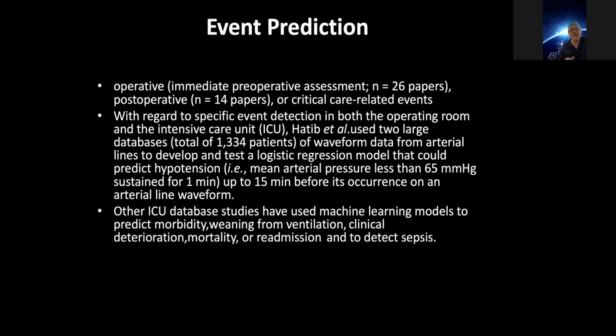It's very difficult for us to predict, for example, hypotension. Right? I mean, I obviously measure the blood pressure on a regular basis in the operating room, but to predict when the hypotension actually occurs, when mean arterial pressure is less than a certain level, is very difficult for me, because I look at one value, well, I could predict something and so forth.